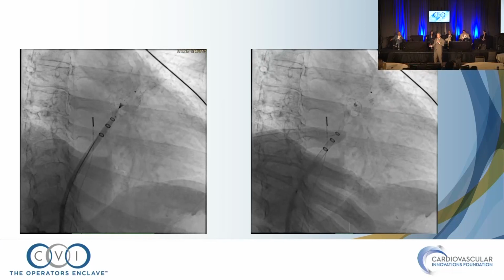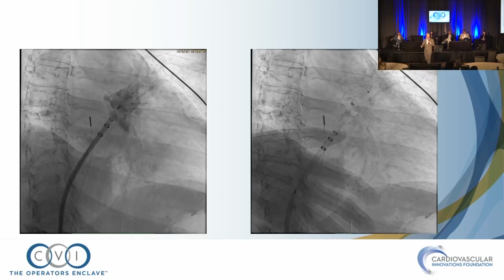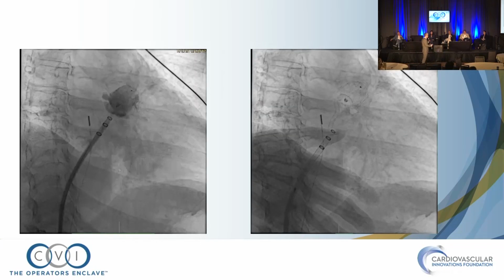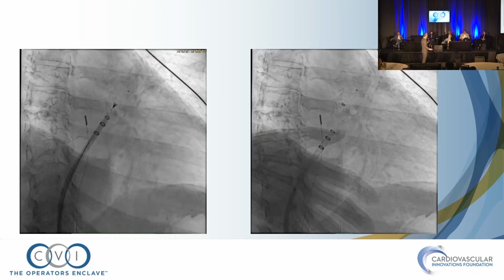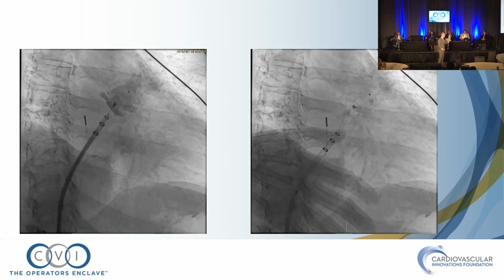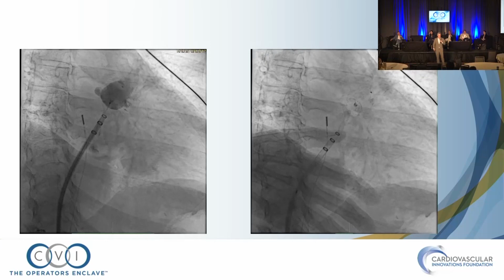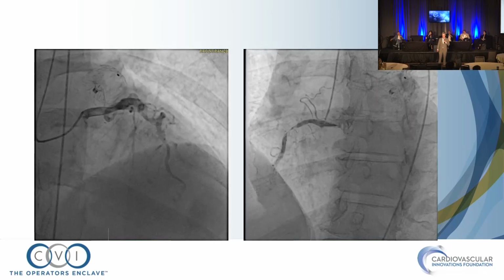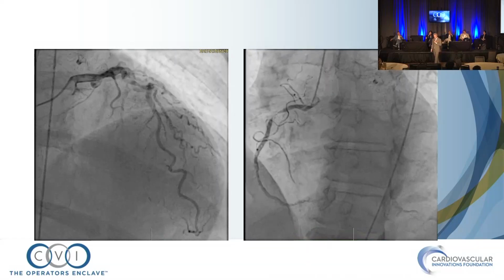And a lot of times, if you have air embolization, if you're doing an ASD or PFO closure and air somehow inadvertently gets into your system, it'll tend to go down the right coronary artery because it's an anterior vessel. And it also tends to go away. It just goes away within a few minutes, a tincture of time. This was not going away. And so we were obligated, of course, to shoot this patient's coronaries.